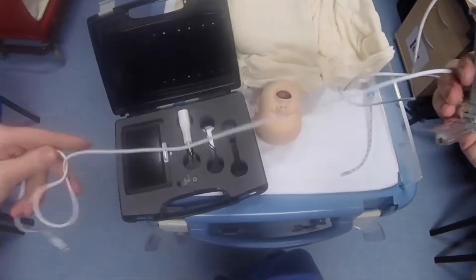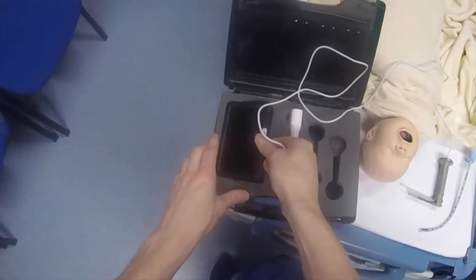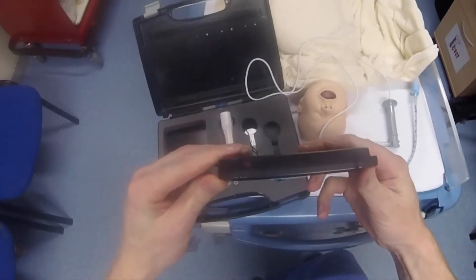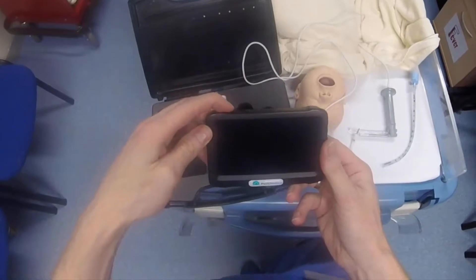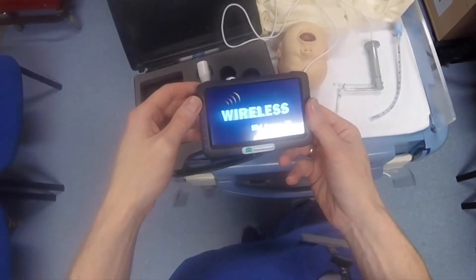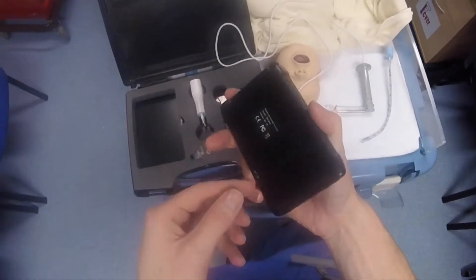You've got a nice long cable here, which plugs into your video monitor. This is the video monitor — it's a long hold to turn it on, and it has a little stand at the back as well.